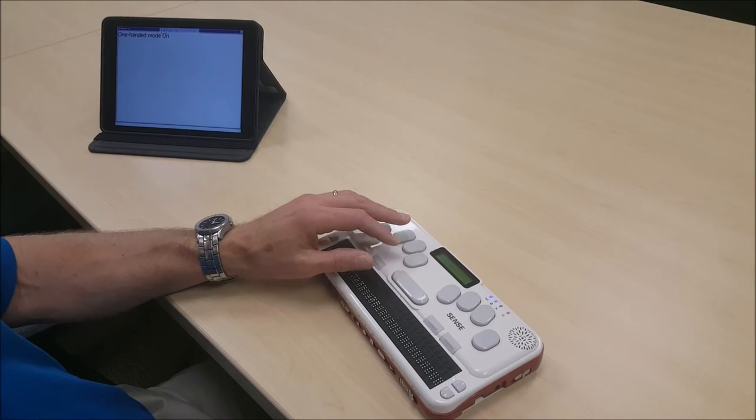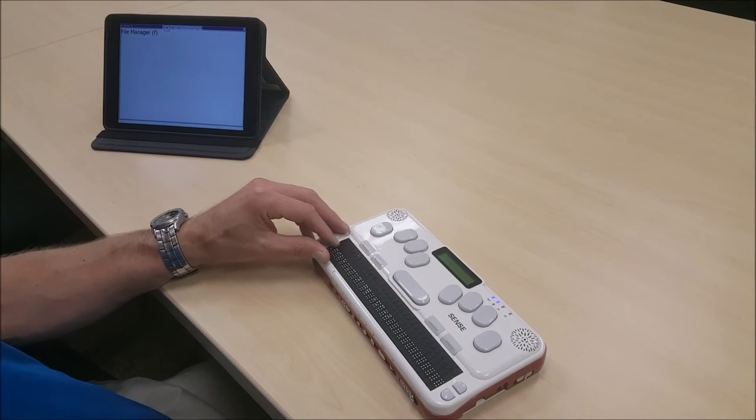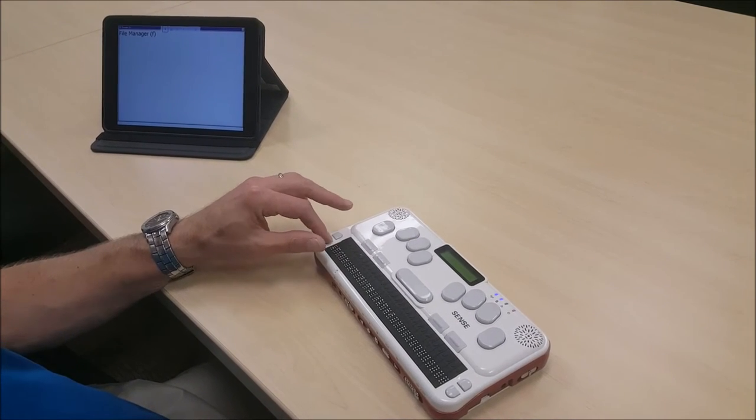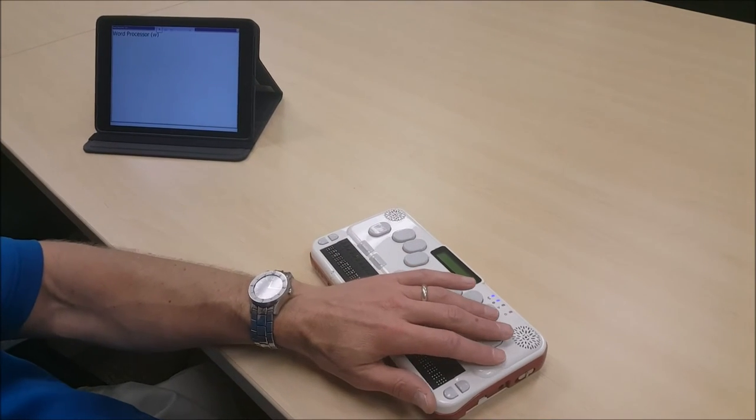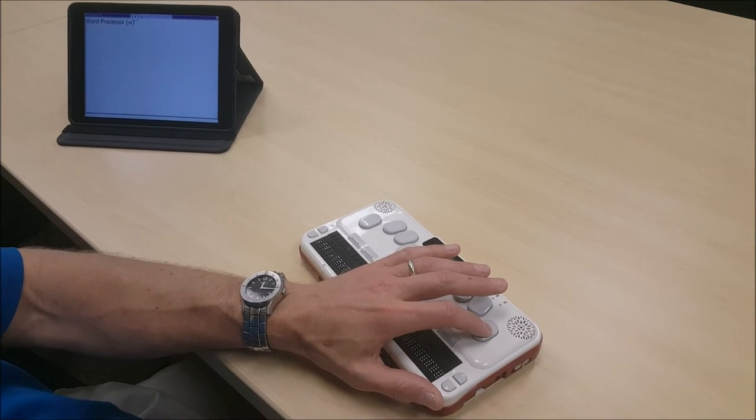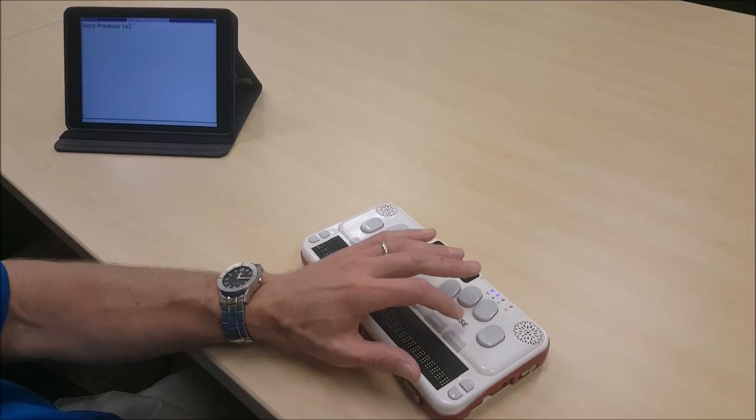One-handed mode on. Now one-handed mode is turned on on my braille sense. I'm going to scroll down to my word processor. Word processor W. And I'm going to press enter, and in this case, because one-handed mode is on, I'm going to press enter twice.